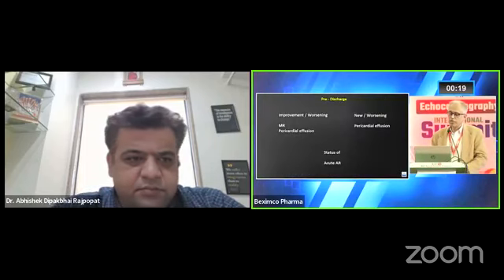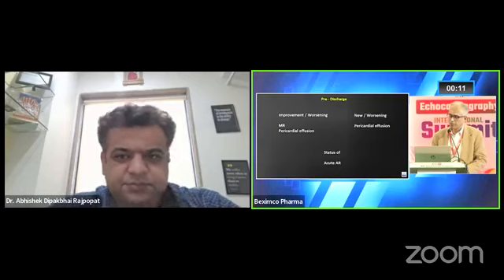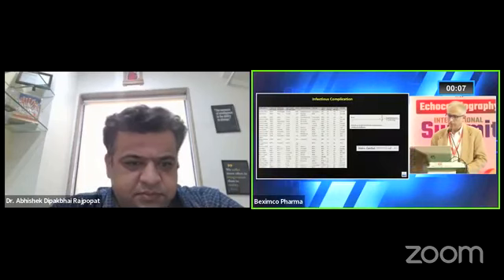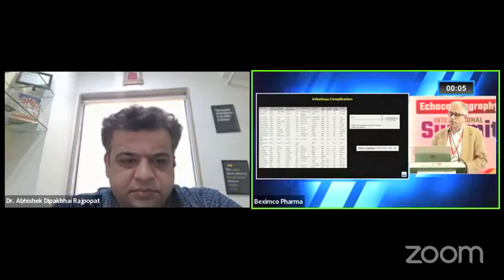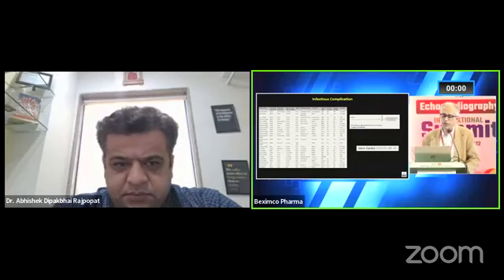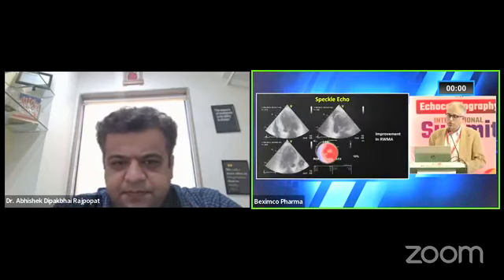So pre-discharge, as far as post-PCI is concerned, you're going to look at the improvement or worsening of any MR, pericardial effusion, what is happening, you're monitoring it, any new pericardial effusion, and then the status of acute AR, again very rare, but it can happen. And one of the few things we are now seeing a little more is infections. So there is infection in terms of an abscess, infection in terms of pericarditis, aneurysm. So these can happen.